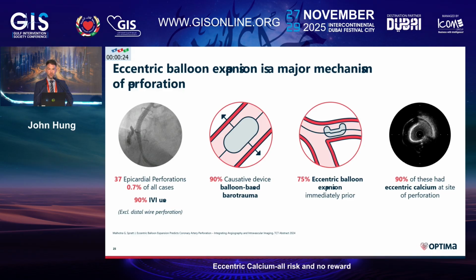Because most of the cases were imaged, it was possible to go back and then assess what the calcium actually looked like. And unsurprisingly, 90% of these cases had eccentric calcium. So I think probably it is an underappreciated risk, and it shows that in this series, it accounted for most of the perforations.